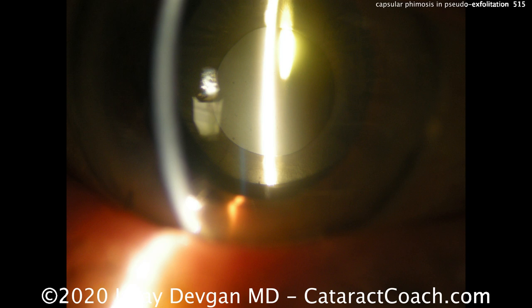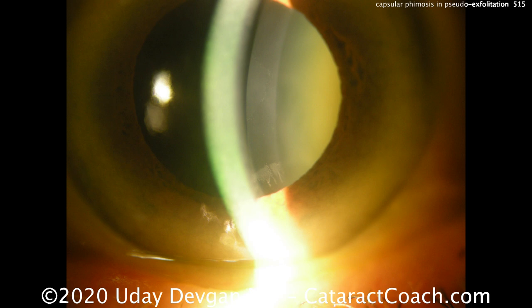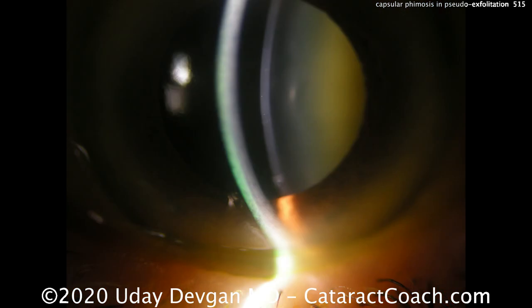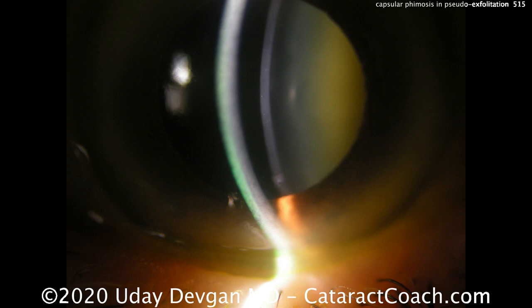You can see the big gap between the iris and the lens. When the capsule contracted, the IOL was pulled back posteriorly, closer to the retina. Here's our eye we're going to operate on — dense cataract, shallow AC. We know: don't aim for plano, aim for minus 0.5, even minus 0.75. In the long term, once that eye heals and the capsule contracts and there is that phimosis, the IOL will pull closer to the retina, and we'll be happier that we chose the higher IOL power.